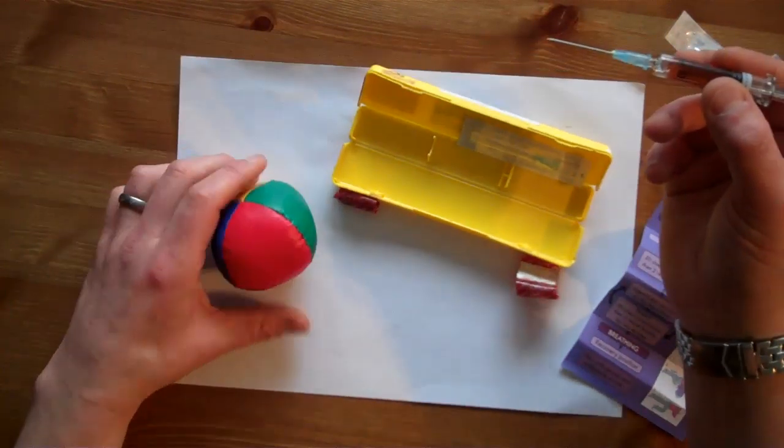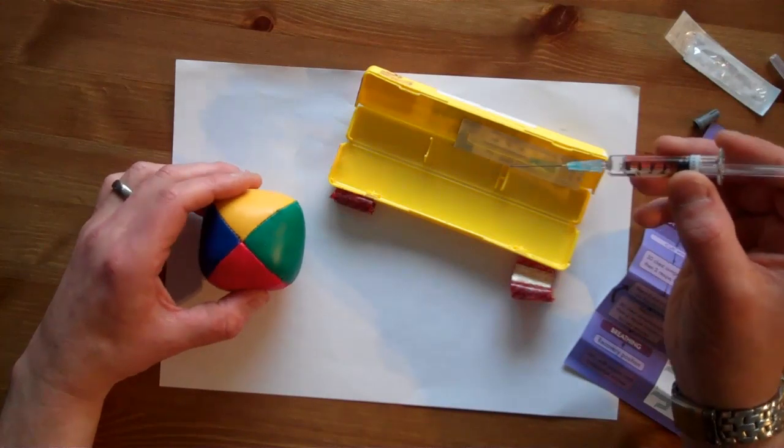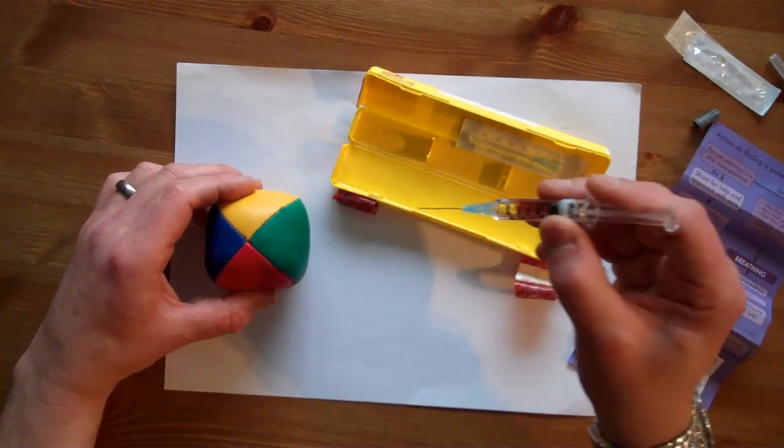If we were imagining this was the casualty's leg, then we would inject at a 90 degree angle to the surface of the skin, straight through.